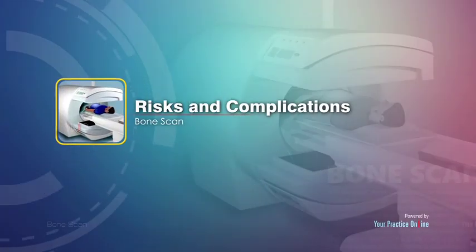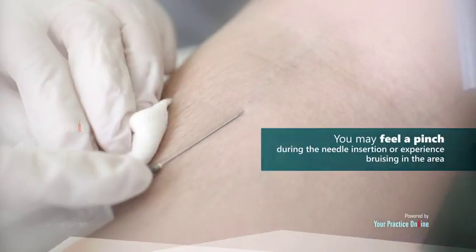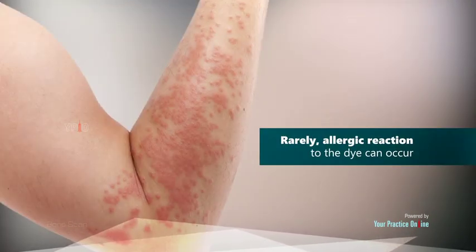Risks and complications. There are minimal side effects from a bone scan as the tracer material produces negligible amounts of radiation exposure. You may feel a pinch during the needle insertion or experience bruising in the area. Rarely, allergic reaction to the dye can occur.